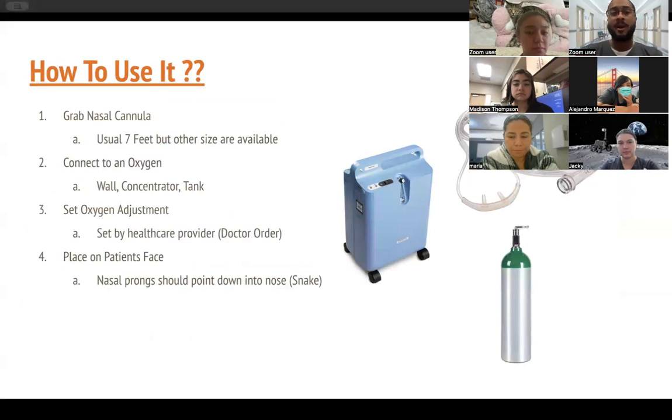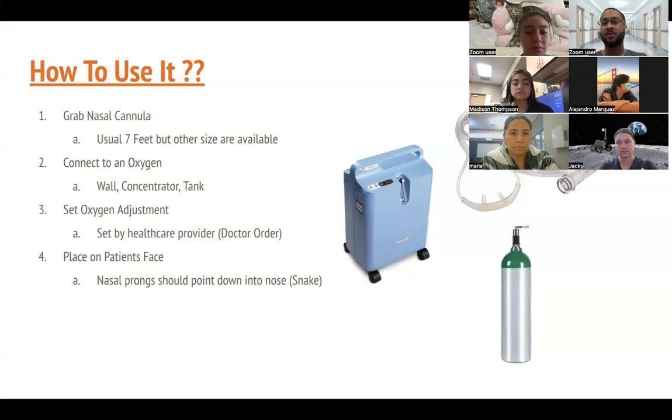You may be wondering, how do you use it? Well, it's super simple to use a nasal cannula. You first, of course, grab the nasal cannula. They usually come in different sizes, the most popular one being 7 feet, but I've seen it go up as much as 15 feet, and you can also add extenders. But you'll grab the nasal cannula, which is here.